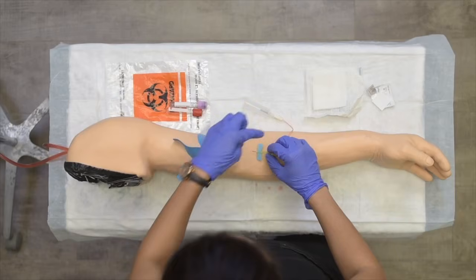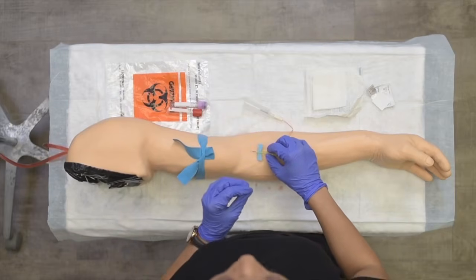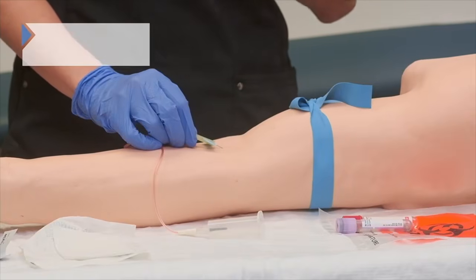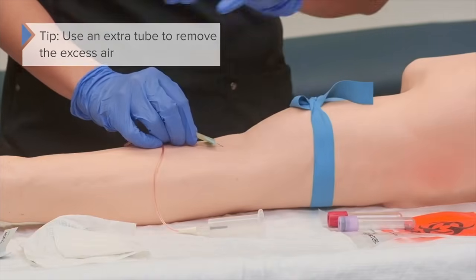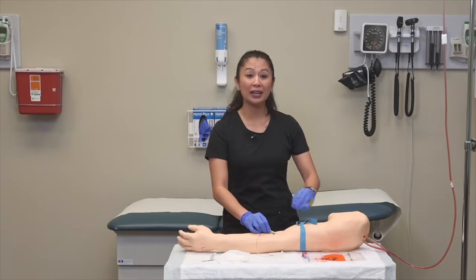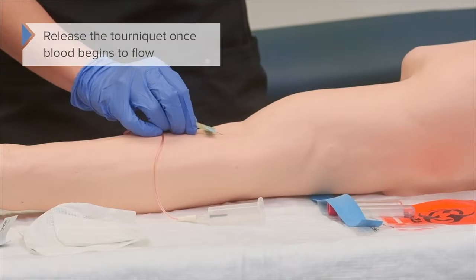Now sometimes because of this extra tubing, there can be some air that gets into the tubing. We do not want this in our lab sample. Therefore, it's a great idea to use an extra tube, what we call a waste tube, just to remove the excess air. Now once we're ready, and that blood is free flowing, go ahead and release your tourniquet here.